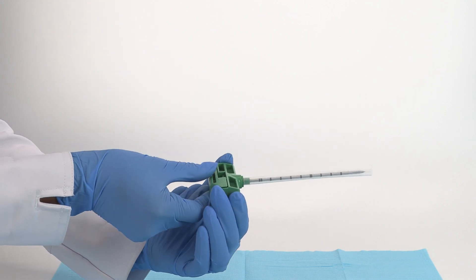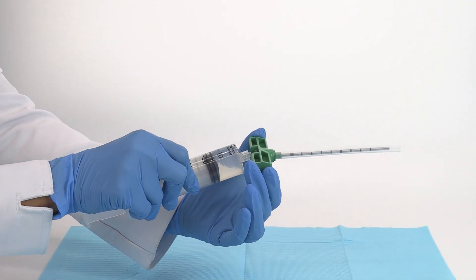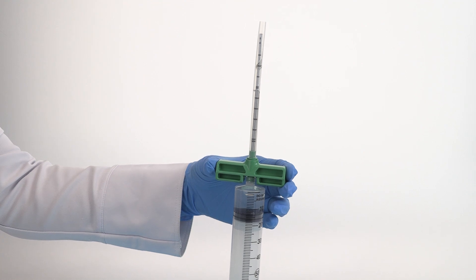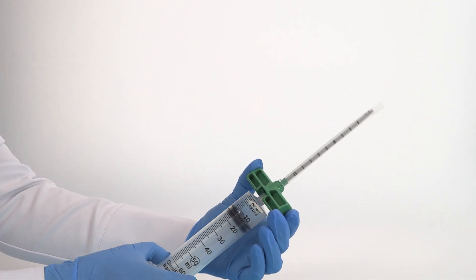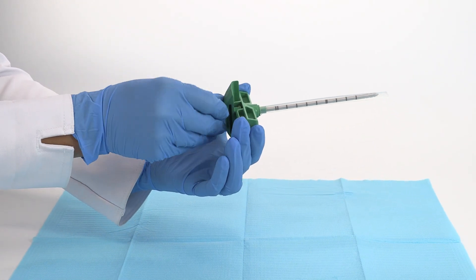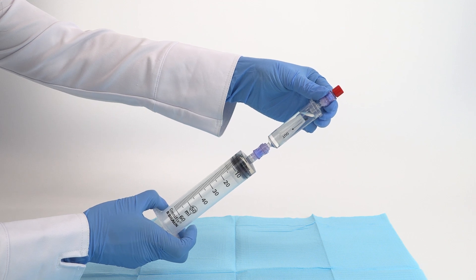Remove the stylet from the bone marrow needle and prime the needle, then reinsert the stylet. Connect the heparin syringe to the outport of the BMA filter and prime the filter by injecting and removing the anticoagulant.